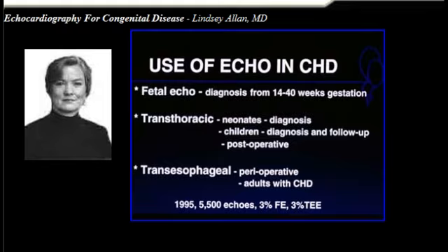So not only is it important for you to know the use of echocardiography, but it's also important for you to be able to understand the images, because if this is the only visualization of the anatomy you're going to get, then you have to be able to interpret them yourselves and therefore translate that into what you're going to see in the OR. Right, we'll start with the first slide, I hope.